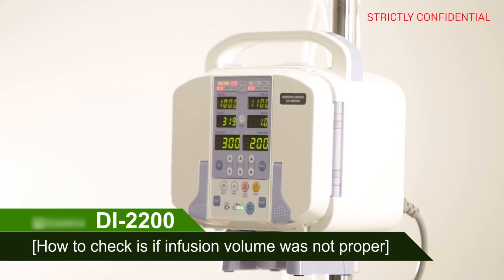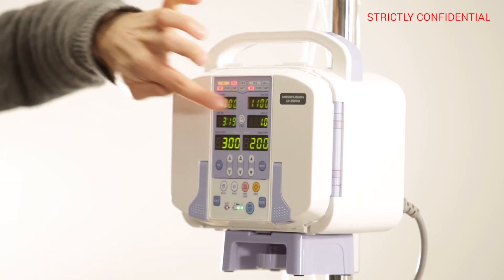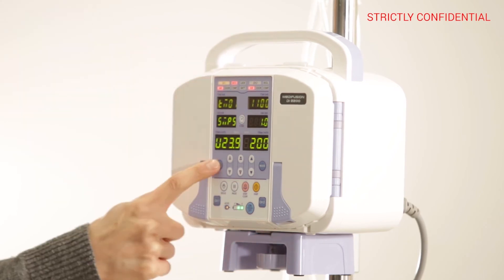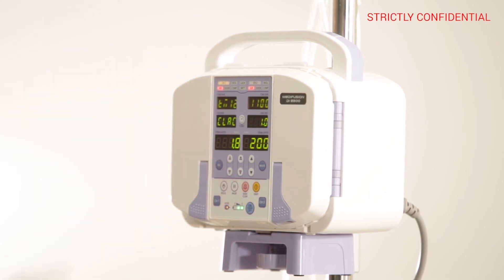How to check if infusion volume was not proper. After activating CHANNEL 1, press the R-TIME and STOP button at the same time for 3 seconds to enter the service mode. The number and F-rate display is the default calibration value. If an error occurs in infusion volume, use the arrow keys to enter the corrected figure.